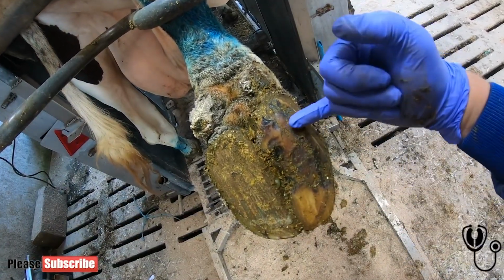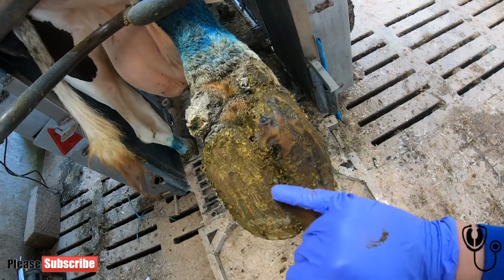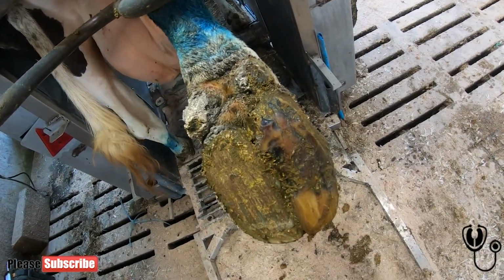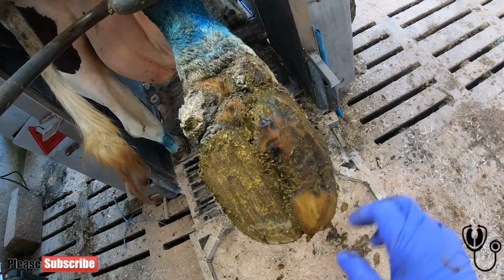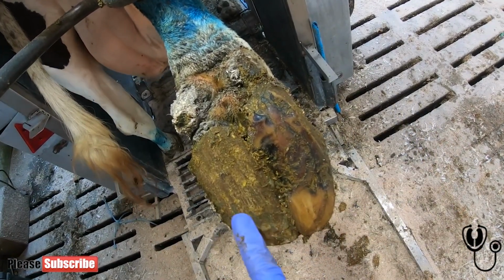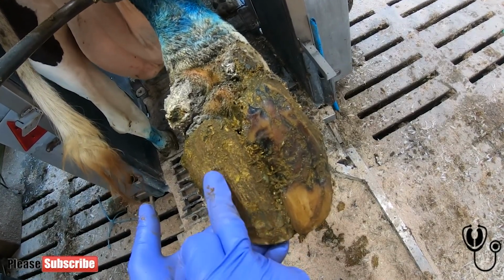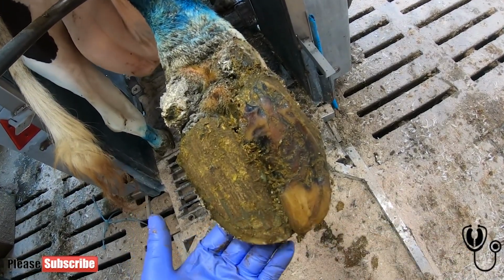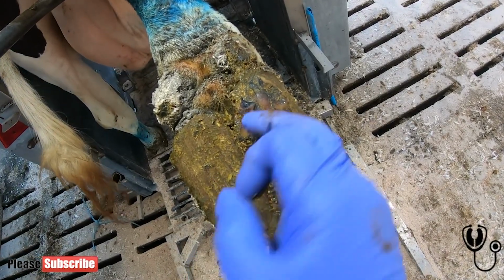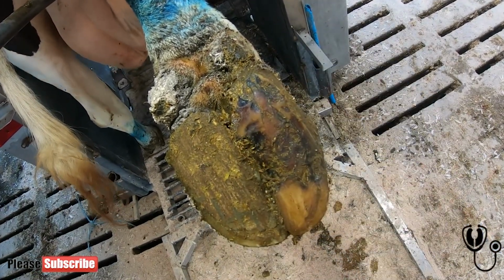I think this cow's had a white line problem here, possibly the start of an ulcer last time she was trimmed. She's had a wooden block. It's nearly worn out. You can see the glue there. See the little square pattern. So what we're going to do is remove that block because it's not really doing much good now. We're going to trim this back and see what the crack is.